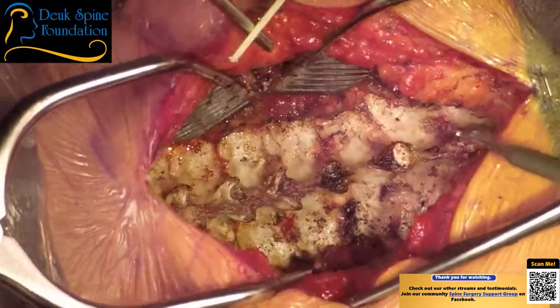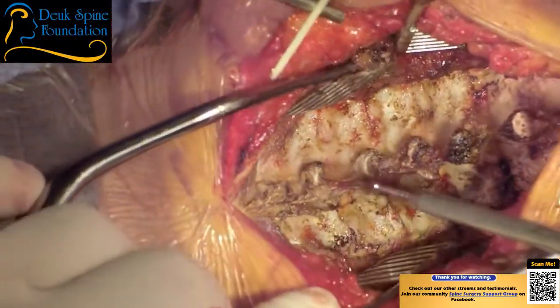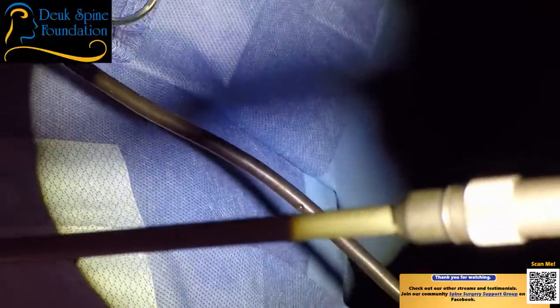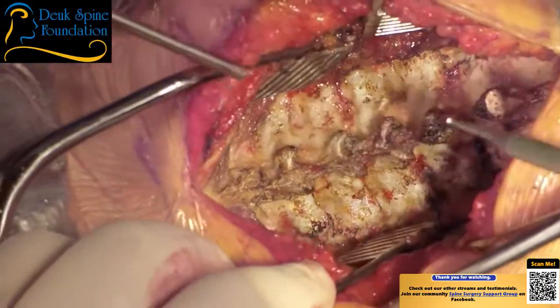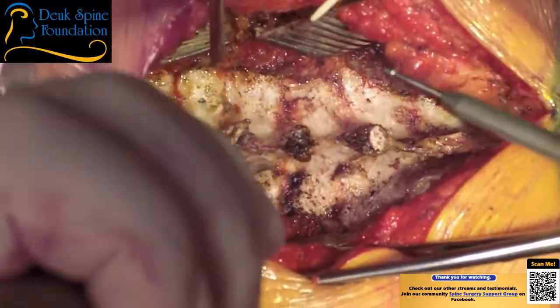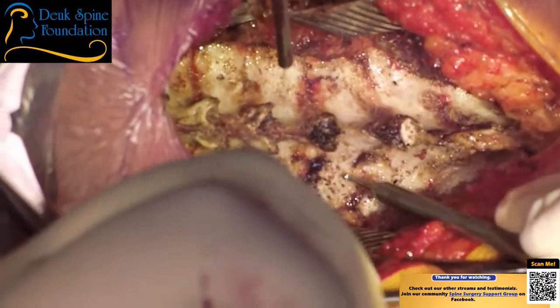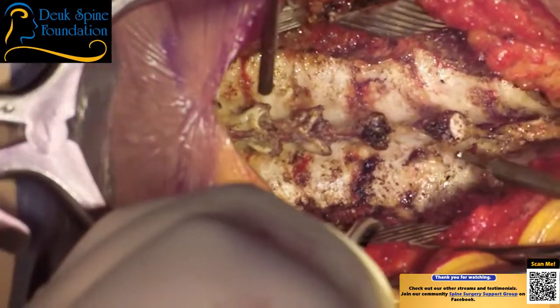And we've talked about this before, but you need three things to promote fusion. You need the right cytokines to promote fusion. Where's my pedal? Okay. We call that osteoinduction. I need a cob probably. And then we need a scaffolding, which is your diploic bone, which you'll see shortly, which is osteoconductive. And then we need osteogenic cells, like stem cells, that can make osteoclasts and osteoblasts. So we've got it all right here.